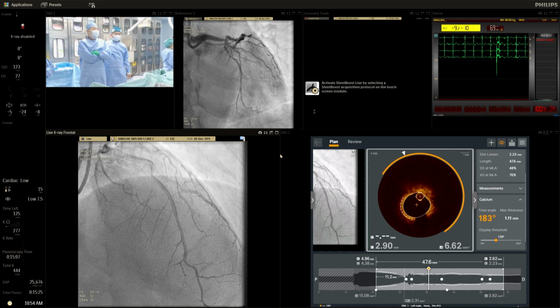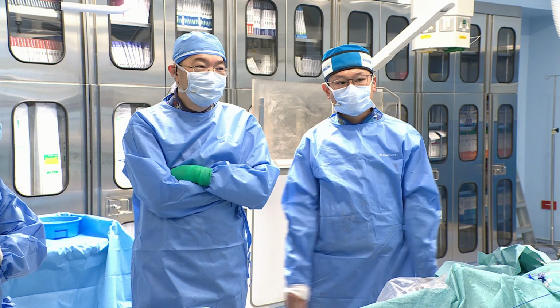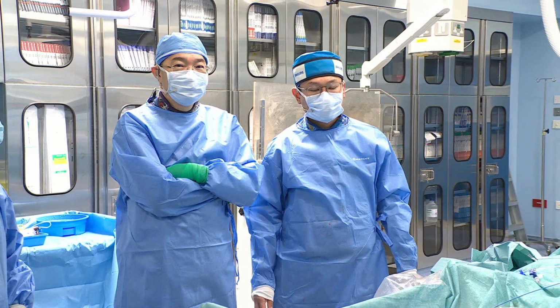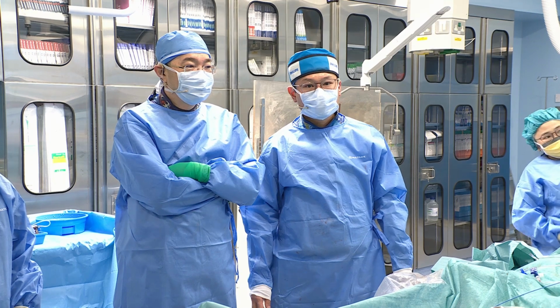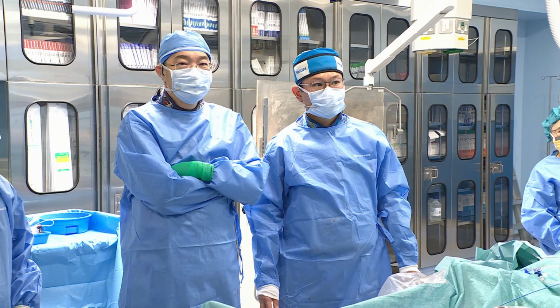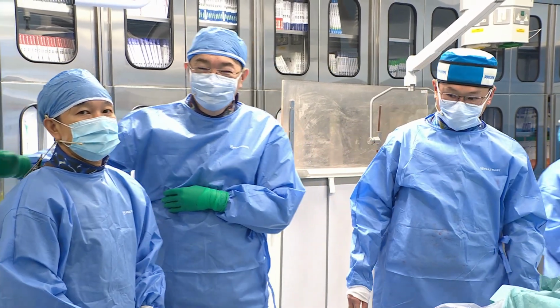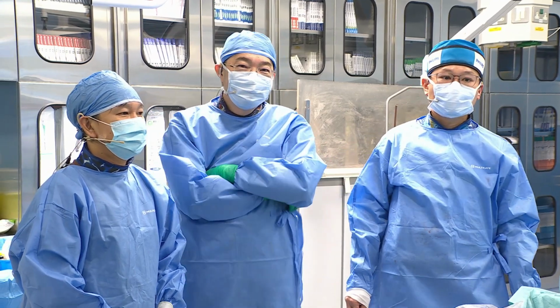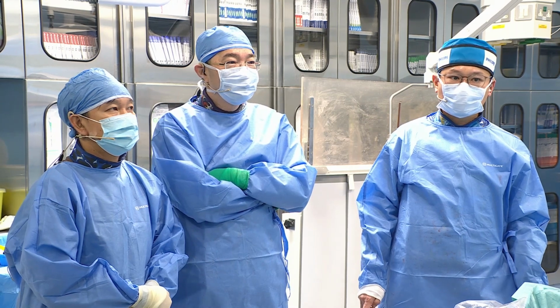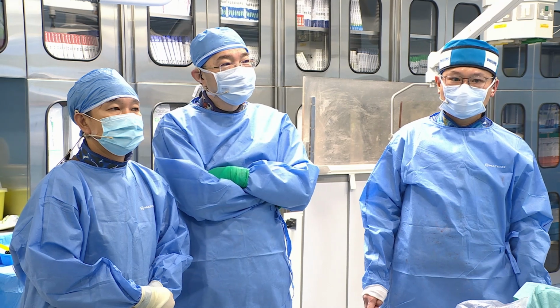Great. I think that was an excellent demonstration, Aaron and Chee. So I think we've all learned very much from this case, and you've demonstrated very well the challenges with left main calcification and what options we should consider, and also the value of intravascular imaging. In particular, OCT can be used in left main intervention in the appropriate patient, like in this case, when there's a good long left main that allows excellent clearance of contrast.